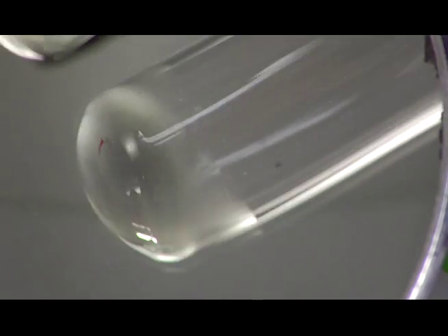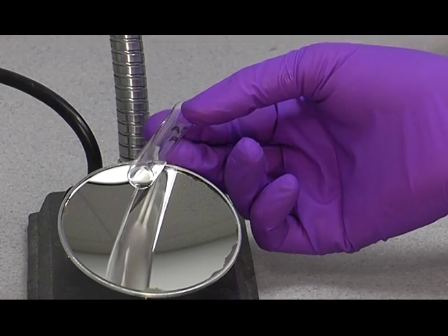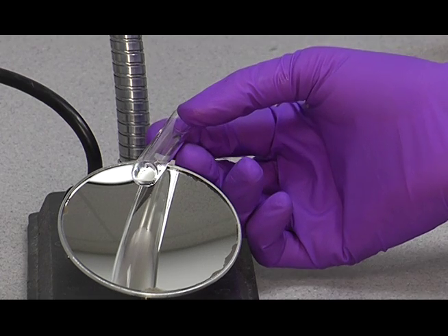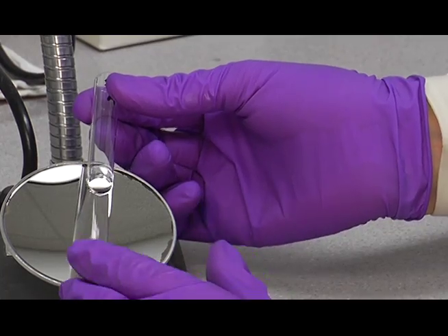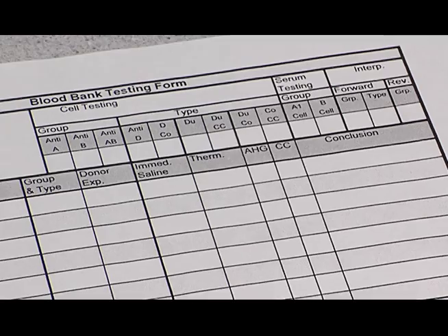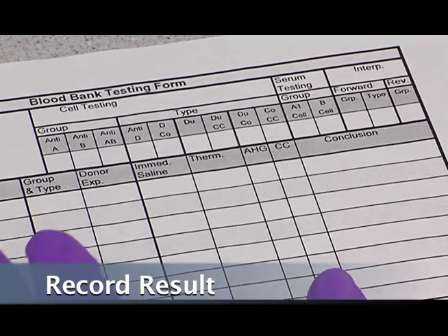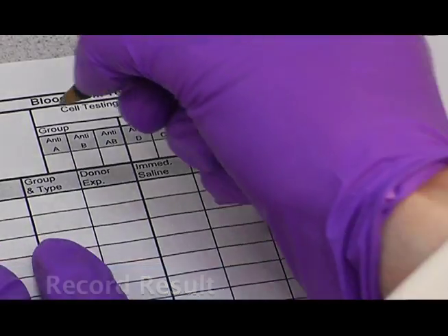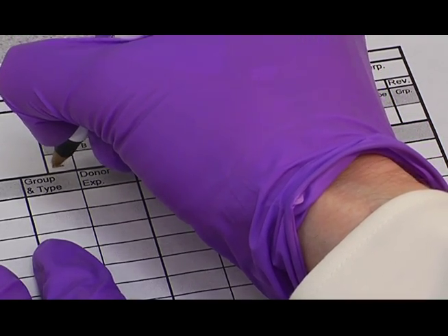Once the cells are completely off the button, then you can give it a little shake and roll the cells down the tube. You can see here that it's a nice negative result. As soon as you have read a tube, then you want to record the result on your result sheet right away. Don't save up your reactions and try to remember what they were.